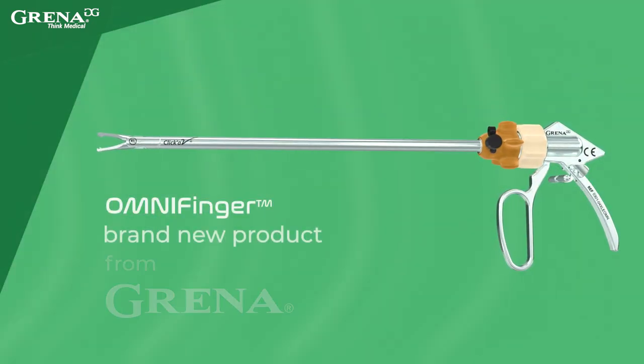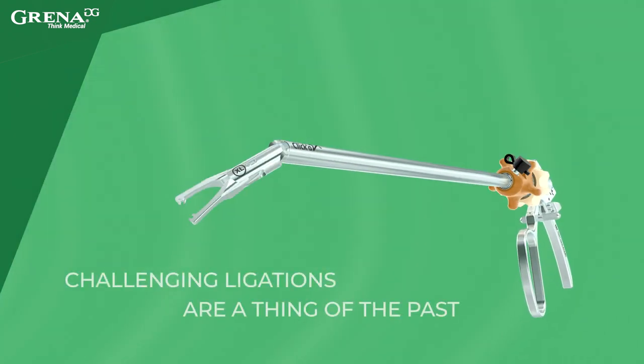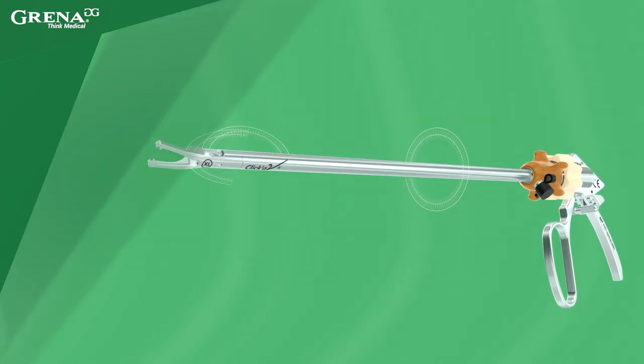OmniFinger, a brand new product from Grena. This innovative articulating clip-applier makes difficult medical procedures easier than ever before, thanks to 3-axis jaw rotation.